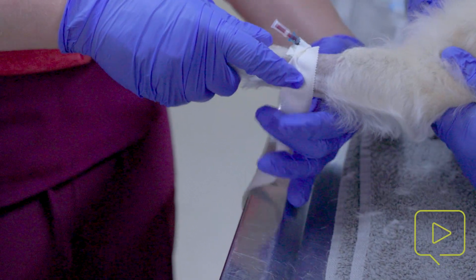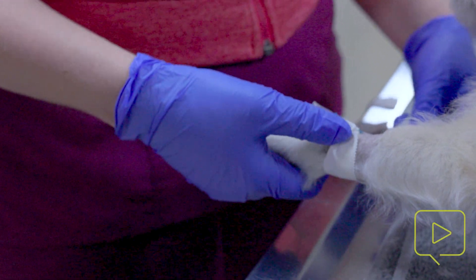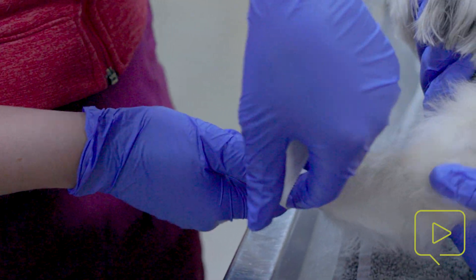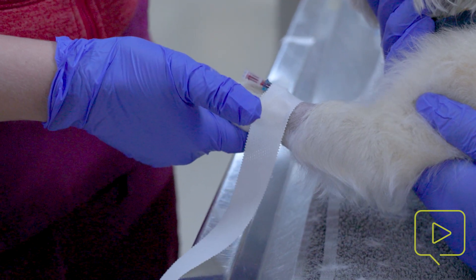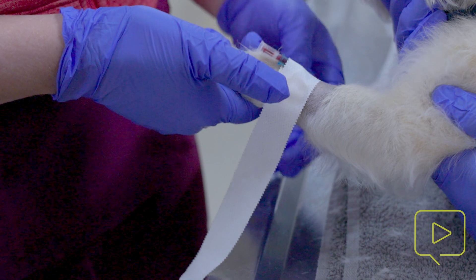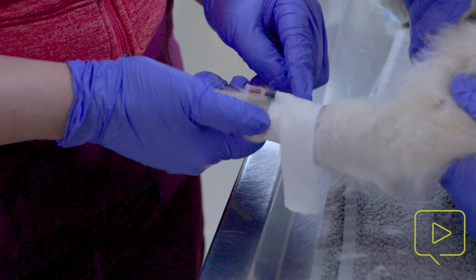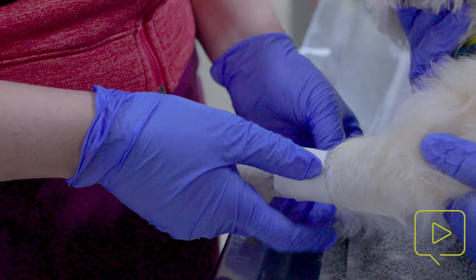Then I'm going to wrap it around the patient. I don't want to put it too tight because I don't want to cut off circulation and give him a fat paw. So I pull it taut down here and then lay it gently over the top. Some patients that are super dehydrated may still get fat paw because once they get rehydrated their tissues kind of enlarge, and that's when you would want to go and re-tape the catheter. Whenever I tape, I like to tape up — wrap up the leg — I only have about a quarter to a half of the tape underneath showing, and then a courtesy tab on the end as well.